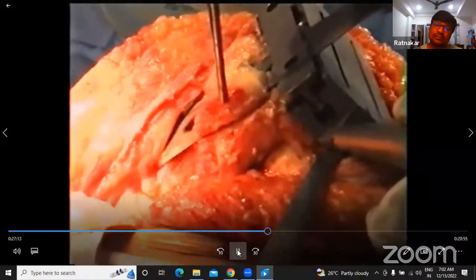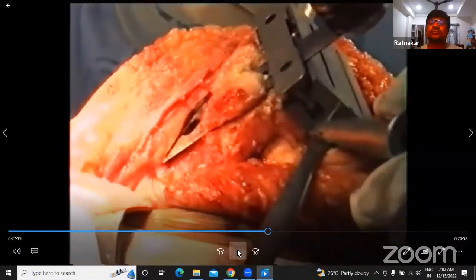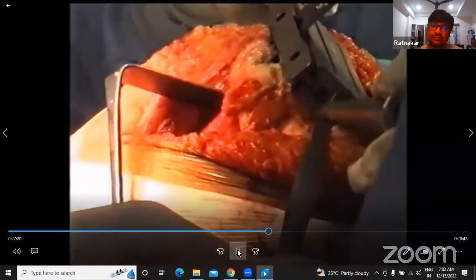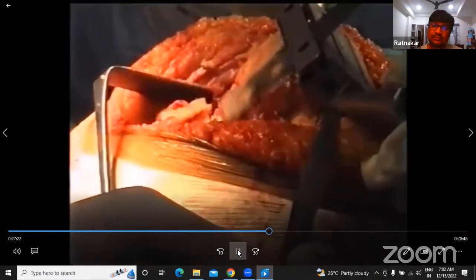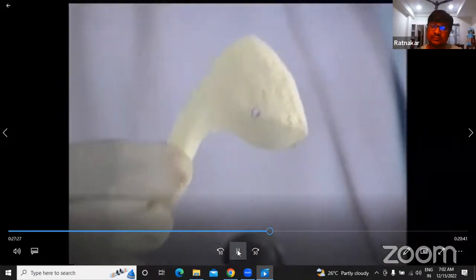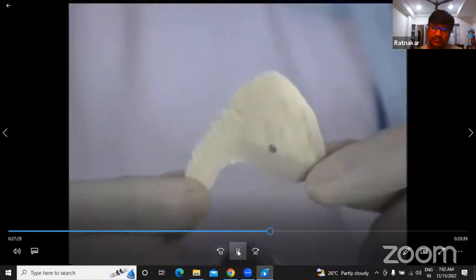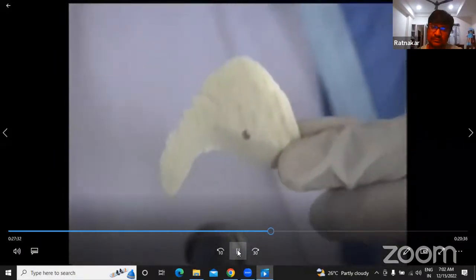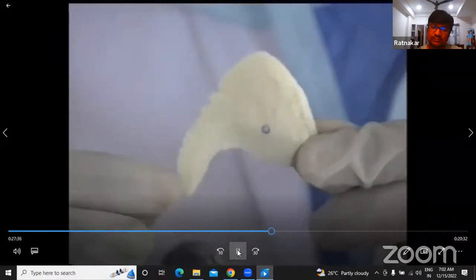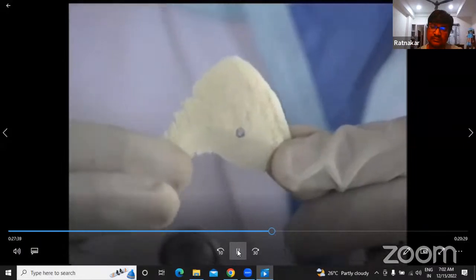Yes. See, that is the cut portion, and my blade is exactly on the anterior femoral cortex. It should not notch. Your cut is perfect. The anterior femoral cut should look like this; it is called the Matterhorn. That is a mountain in Switzerland, which looks like this. Here, that is the thin anterior part of the medial femur, and this is the thick lateral part of the femur.